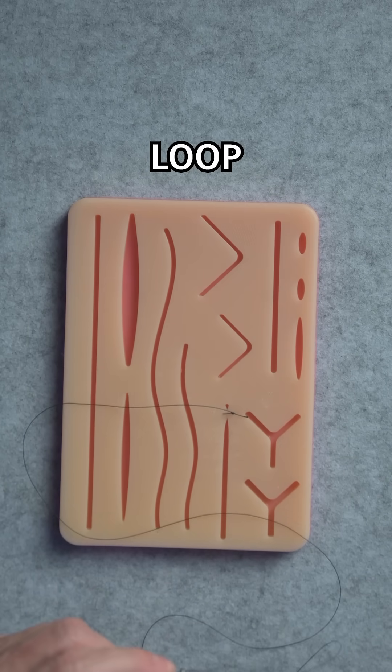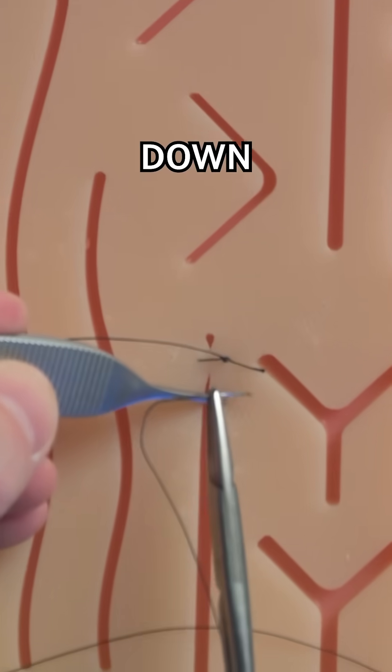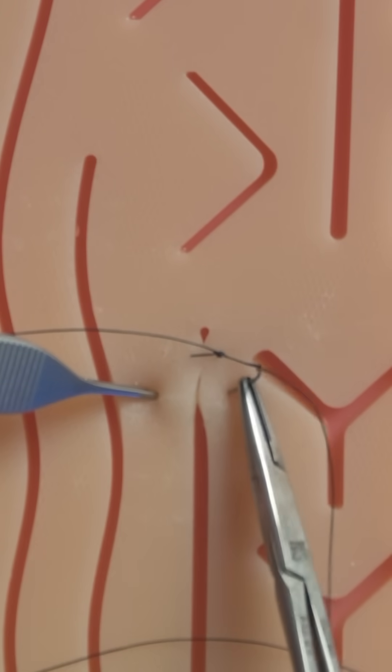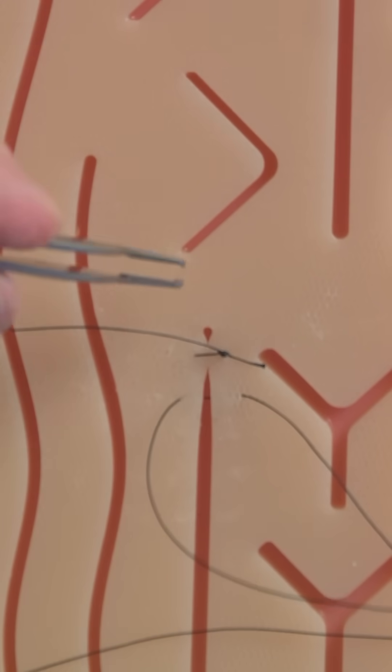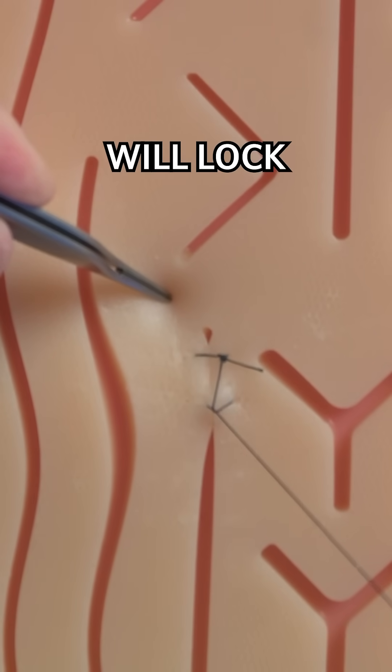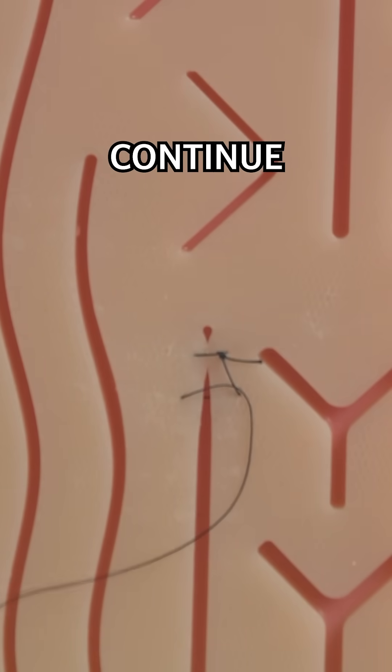We'll leave a slight loop to create the lock and move our needle down half a centimeter. That loop will lock and we continue this process.